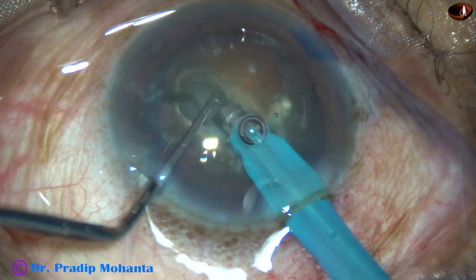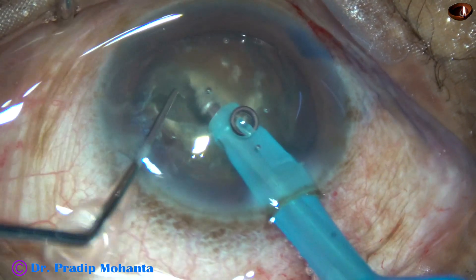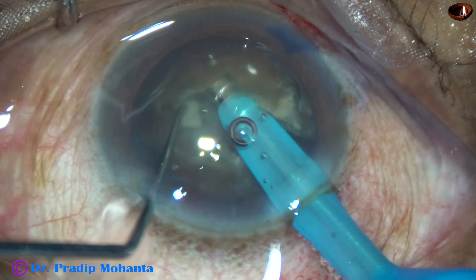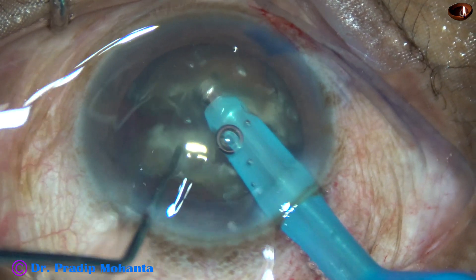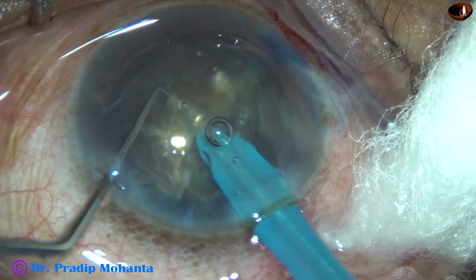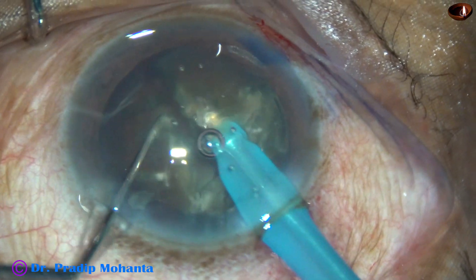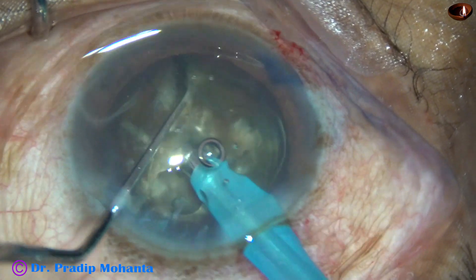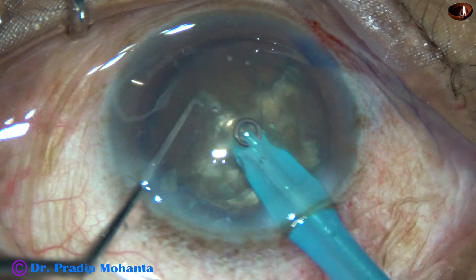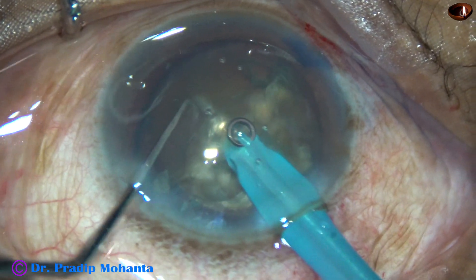Now I rotate 180 degrees and remove the endonucleus, and I try to separate the two heminuclei. But there is a leathery band joining these two heminuclei. This is the larger heminucleus — I am trying to divide this into three pieces. This is a nice crack, and on this large piece, another good crack.